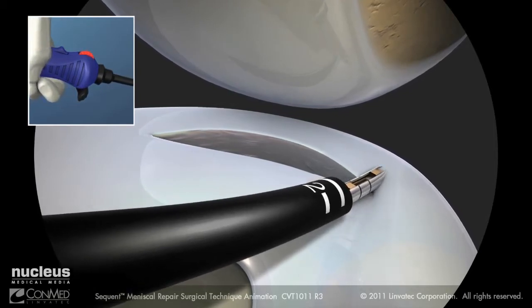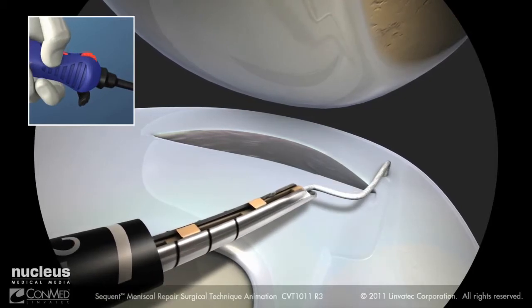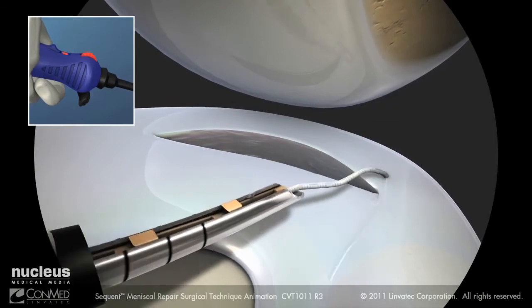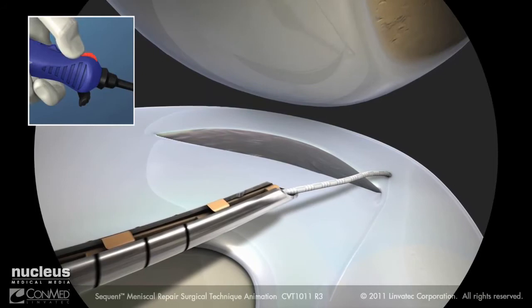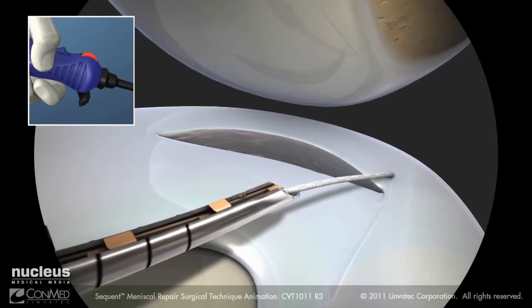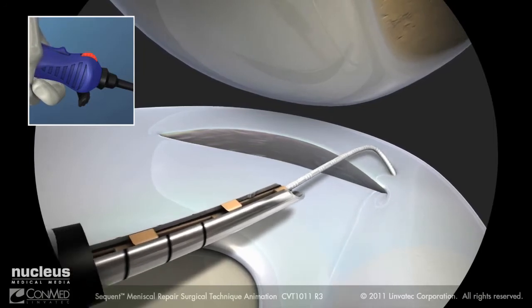Move the switch backwards to the ratchet position to tension the suture. The red dot should be exposed. Pull back on the device and reel the thumbwheel to tension the suture and ensure that the implant is set. Move the switch forward into the freewheel position to create slack in the suture.